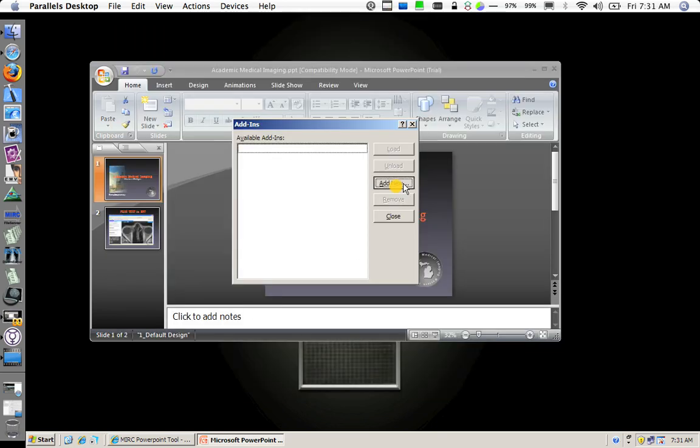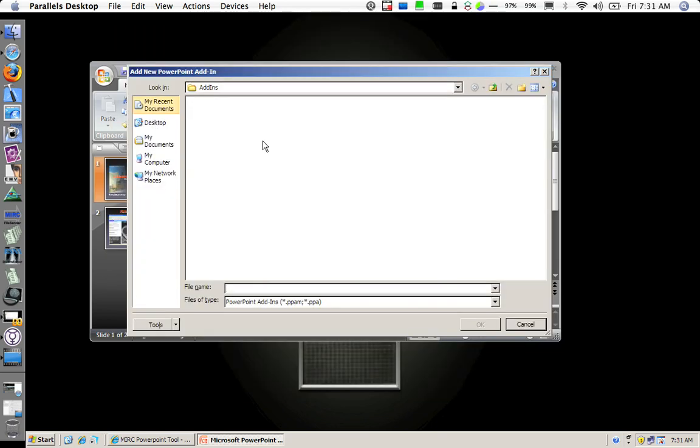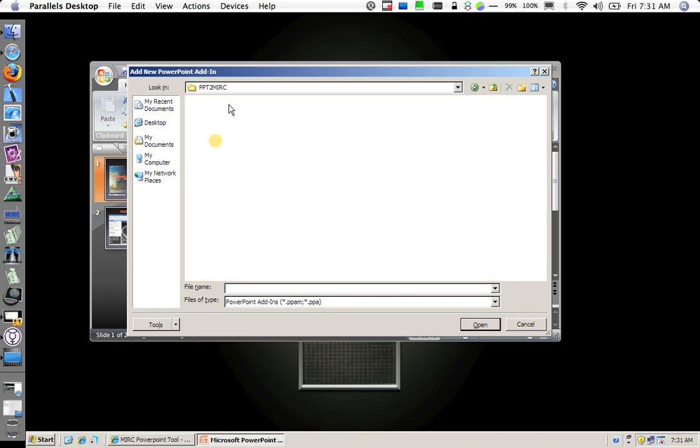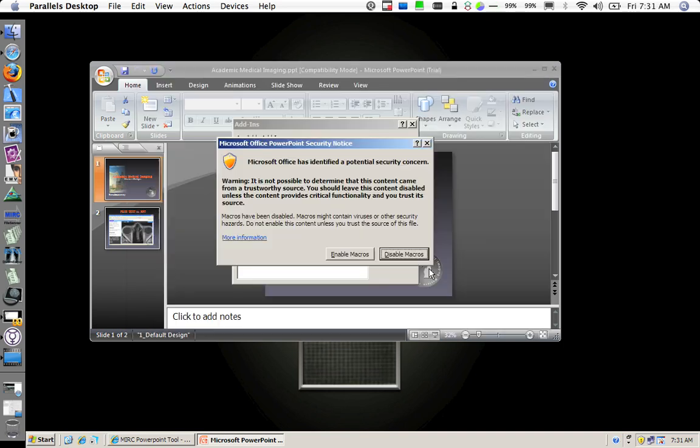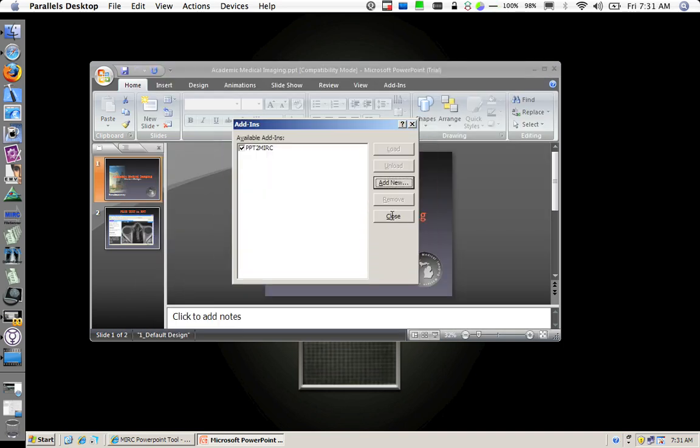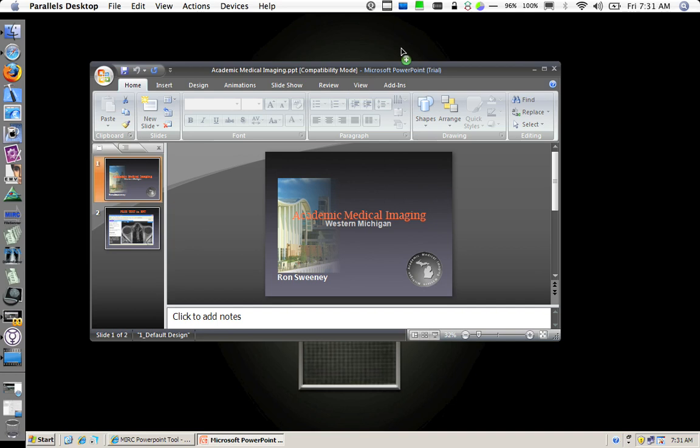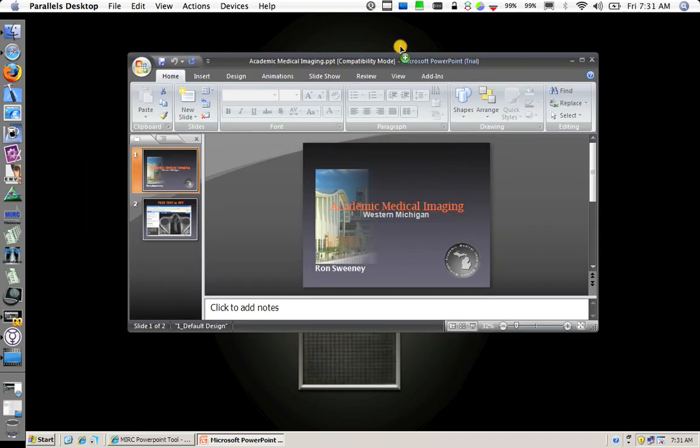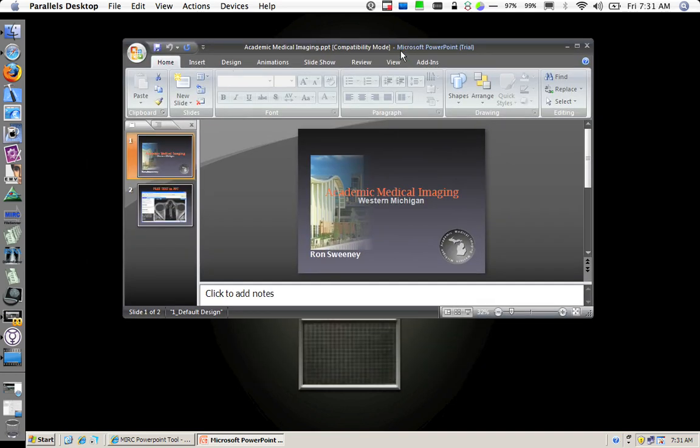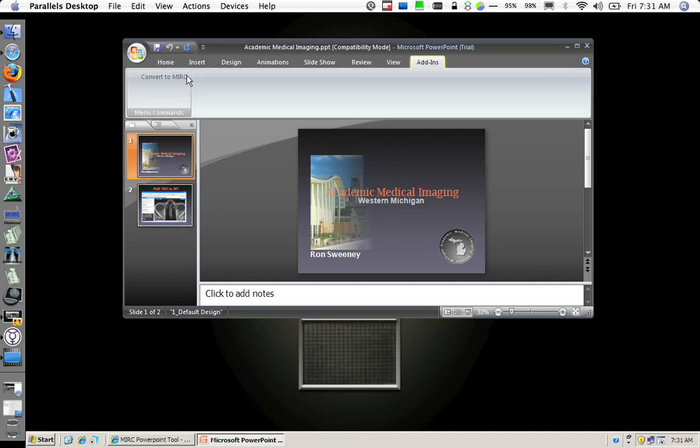I am going to add a new one. Browse to where I downloaded the PPA file, which is right here. Enable the macros on that. And once I have loaded the PowerPoint add-in, the option comes available here on the toolbar. And there you can see convert to MIRC is in my toolbar.